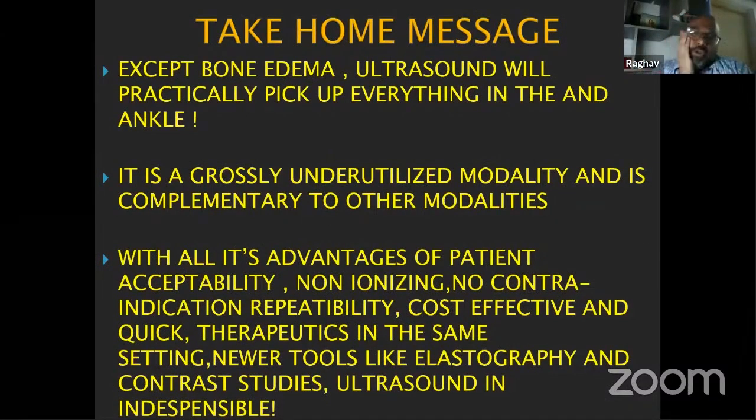So I'm just trying to finish it off, my last slide, that except for bone edema, ultrasound would be practically picking up everything in the ankle. It's a grossly underutilized modality, and it is complementary to any other modality. It will just fit in very comfortably with the other modalities.